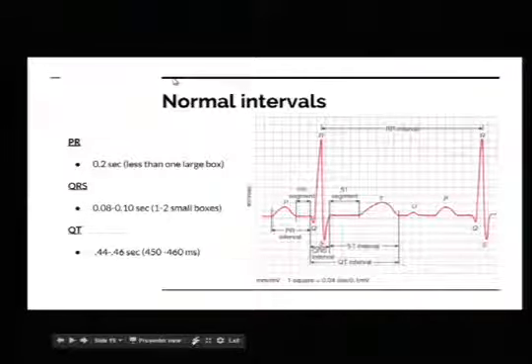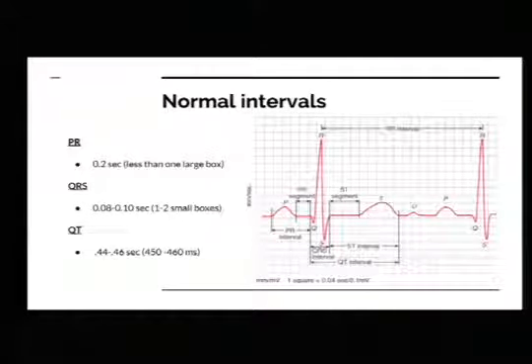And you never memorize all these. Even I have to kind of sit and think about my QT duration. But just so you have an average, so when the computer's spitting out something, you know what the normal is and what it's basing off of. These will change a little bit in pediatrics, but for adults, these are your normal intervals.